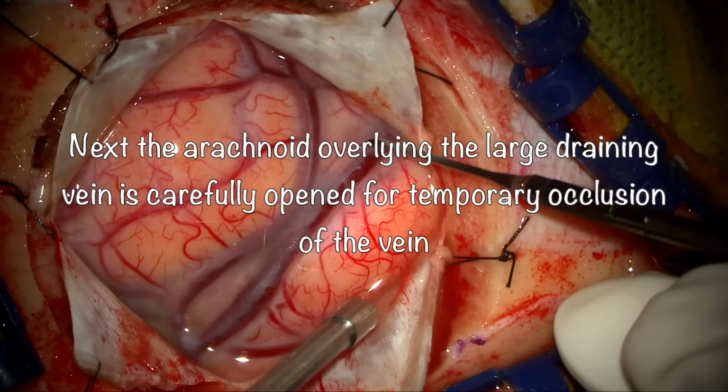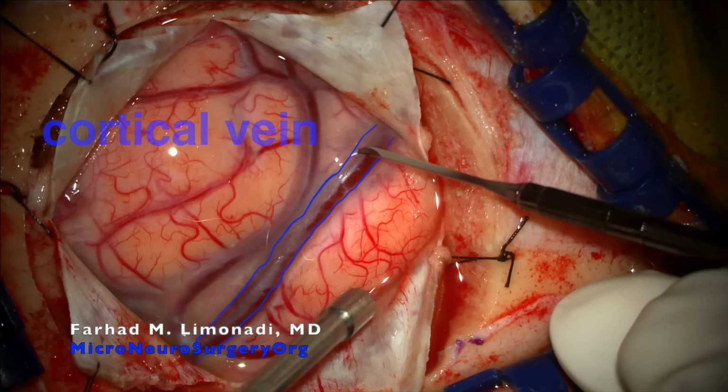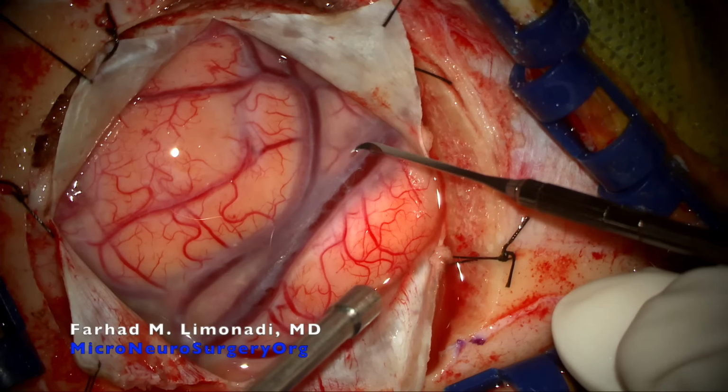Next, the arachnoid overlying the large draining vein is carefully opened for temporary occlusion of the vein and examining whether its occlusion results in any neurological deficit.